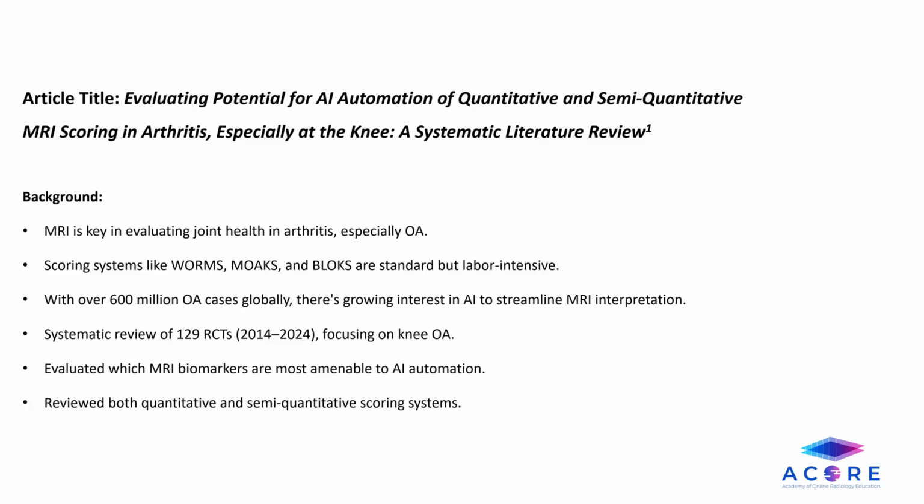This systematic literature review investigated the feasibility of automating quantitative and semi-quantitative MRI scoring systems in arthritis. A total of 129 randomized controlled trials published between 2014 and 2024 were reviewed, with a strong focus on knee osteoarthritis.